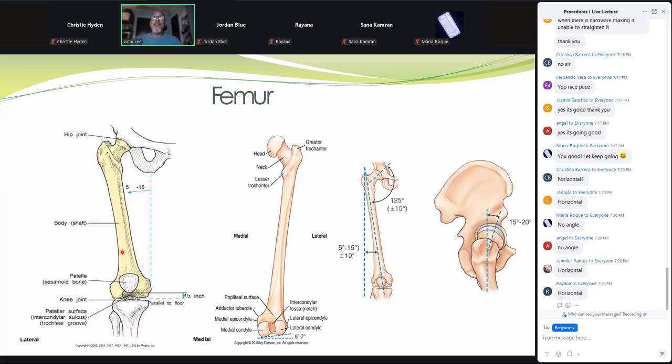In our normal position, that femur is going to angle medially as it goes towards the knee. But when we're standing up trying to take pictures, the normal inclination for the patient is to put that femur vertical. And so they lose that 5 to 7 degree angle on their condyles just by positioning.